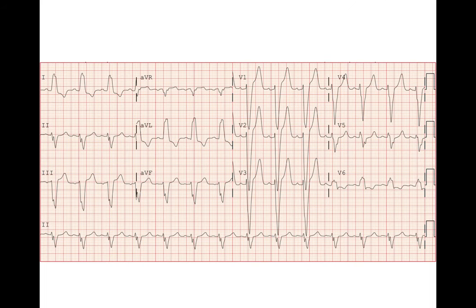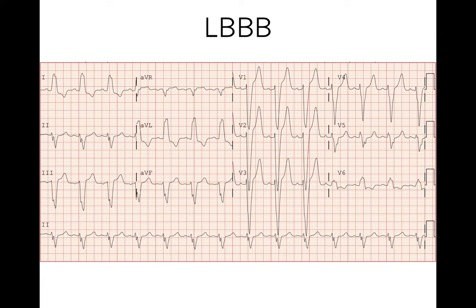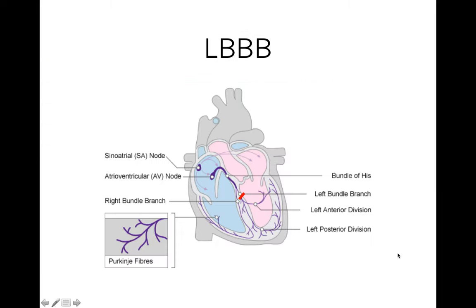What do we mean by SVT with aberrancy? This is an example of sinus rhythm with a left bundle branch block — there's a wide negative QRS in lead V1 and an RSR' in lead V6. If this patient develops supraventricular tachycardia such as atrial flutter, it will look like a wide complex tachycardia, but it's actually SVT from the atrium. In left bundle branch block, there is conduction along the right bundle and then slow depolarization through the muscle towards the left ventricle, producing a large deflection away from V1 and towards V6.